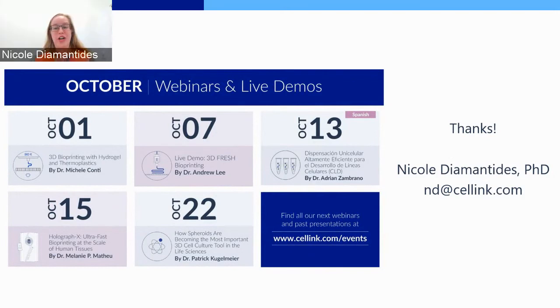Yeah, so that's a great question and it's really dependent on exactly what fabrication methods you're doing, what biomaterials you're using. So the cells themselves can often be cultured or frozen. If I've already taken cells from a patient, I can freeze them to put them in stasis for a time, and then I can restart the process later. But if I've already fabricated a construct and I now have it in culture, becoming a tissue, it's more difficult to pause that process.